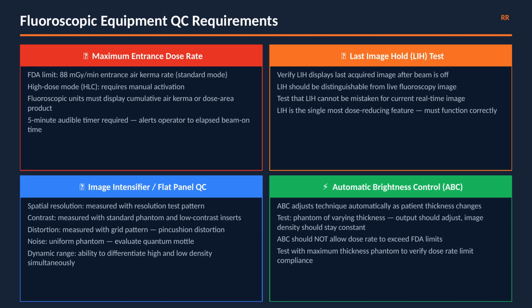Last image hold function. Verify that LIH displays the last acquired image after the beam is off. Test that LIH is clearly distinguishable from live fluoroscopy on the monitor. LIH is the single most dose-reducing feature in fluoroscopy and it must function correctly.